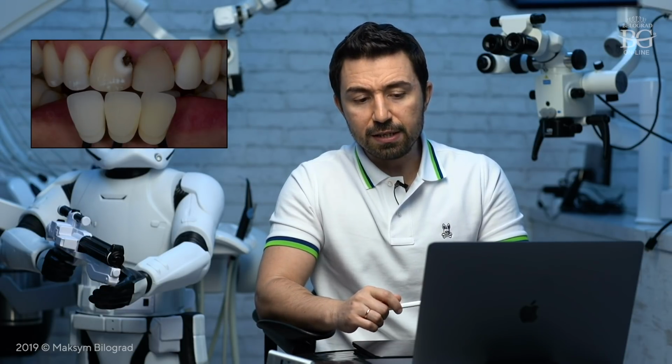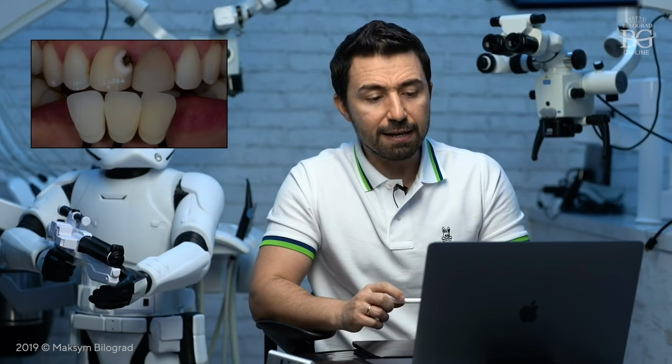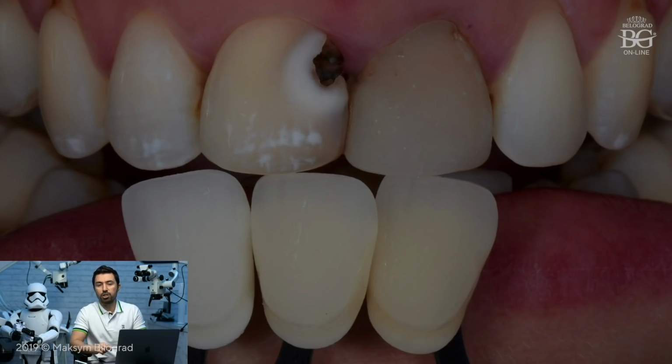A polarized filter removes highlights from the surface, and you can see the core color of dentin. If you also take a picture with some shade guides, with a Vita shade or maybe with the shade guides that your dental technician uses for ceramic build-ups, it will be better because he will be able to understand the color more clearly and more precisely.